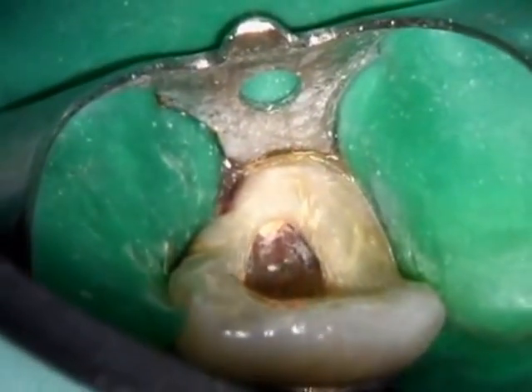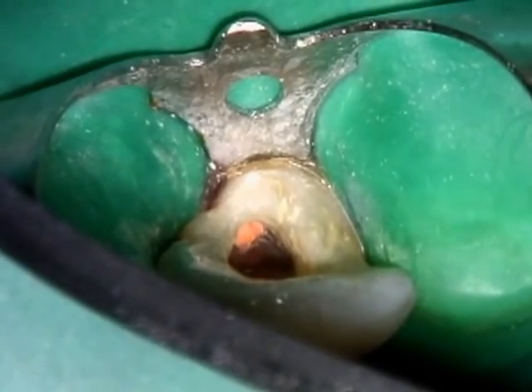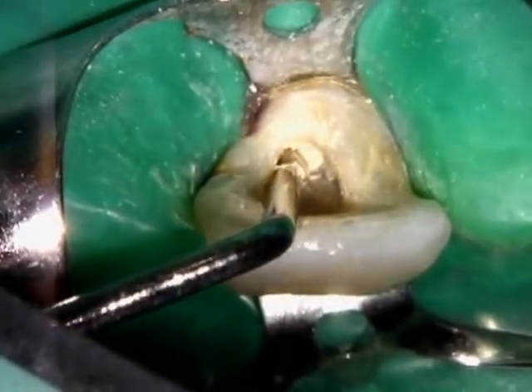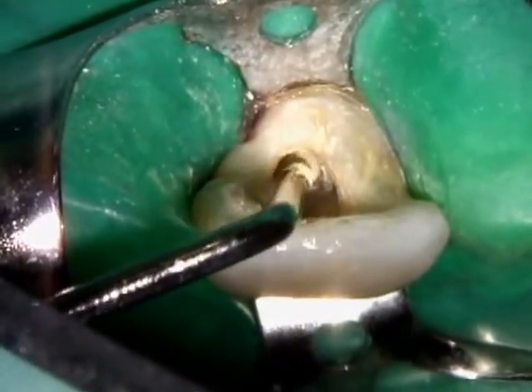All materials should be removed to a level just apical to the gingival margin. Two to three millimeters of restorative material, such as IRM or cavit, is applied on the obturating material.